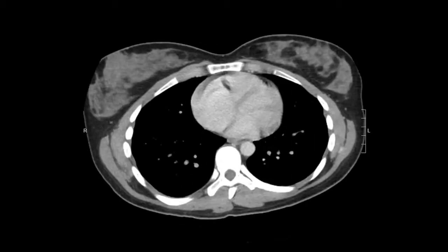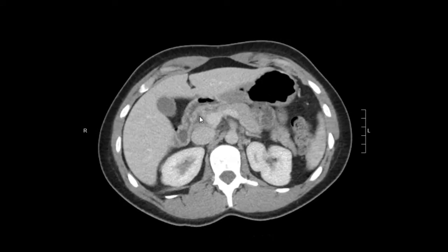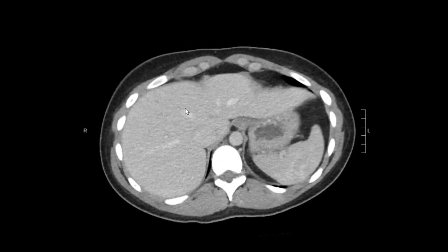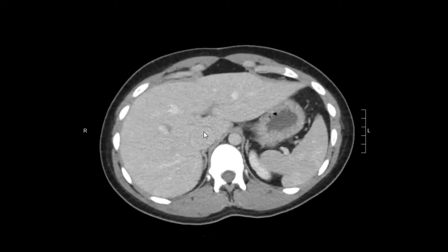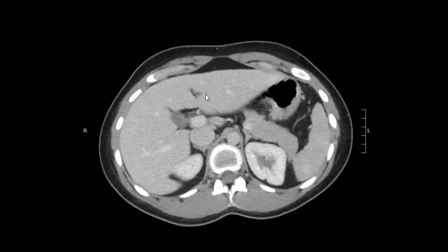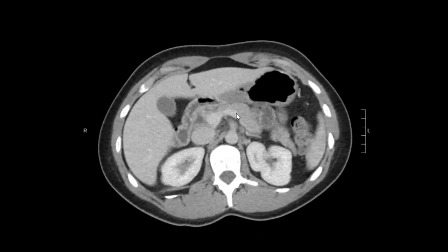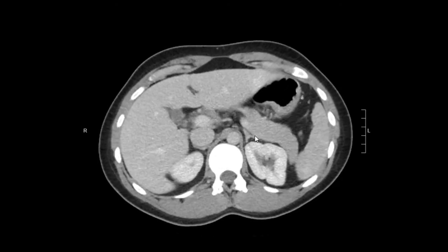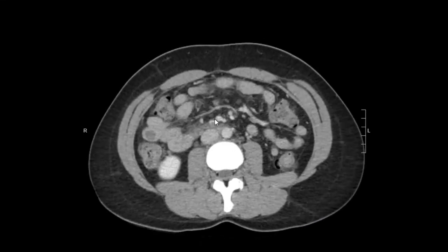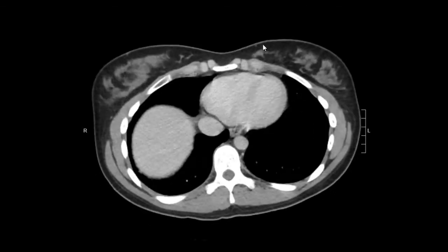Next we're going to evaluate the vasculature. First I look at the hepatic veins and the portal veins. So we have our right, middle, and left hepatic vein. Then we have our right portal vein, our left portal vein, and our main portal vein, with the splenic vein and the superior mesenteric vein.